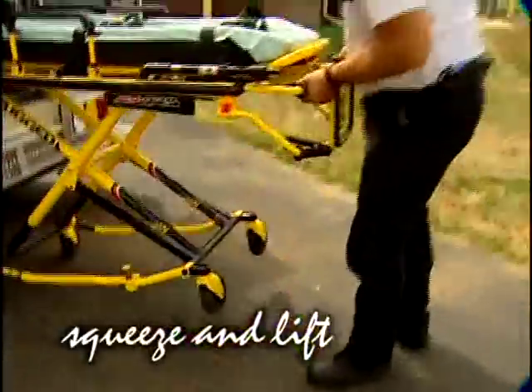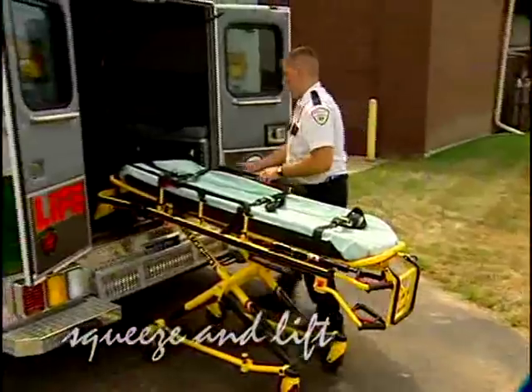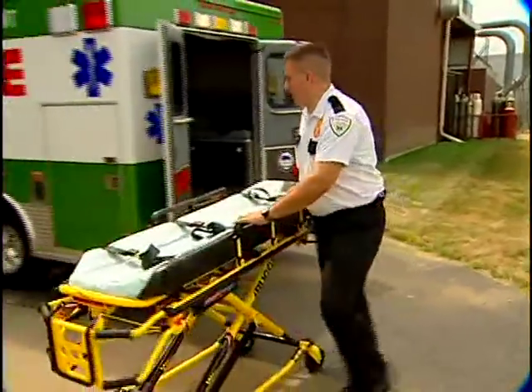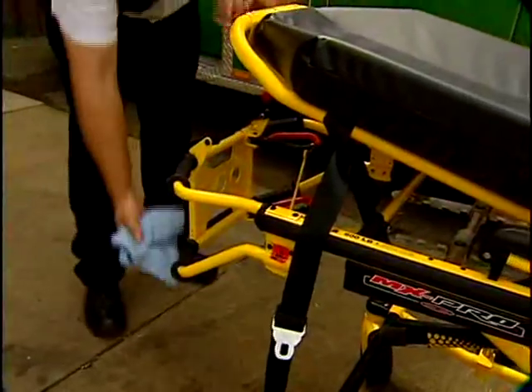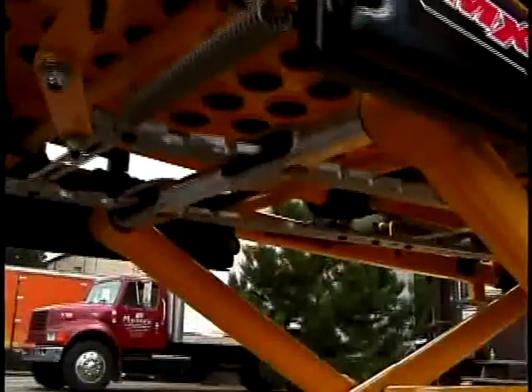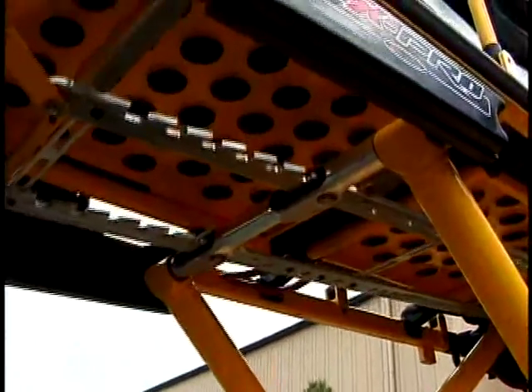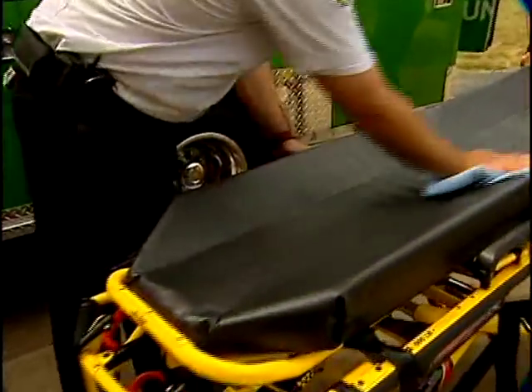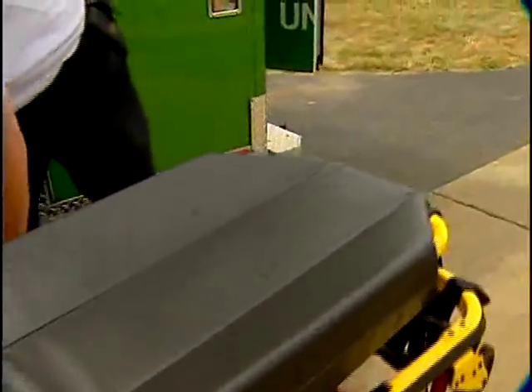Unloading is just as easy. Pull the cot from the fastener and lower it to the ground. Squeeze the release handle and lift the cot until the legs extend and lock. Release the safety bar. The MX Pro is even easy to clean. Its powder coating is durable and makes it easier to see blood and dirt. Greaseless height adjustment mechanisms help to keep your hands and uniforms clean.